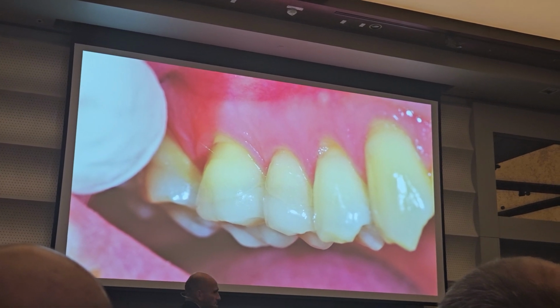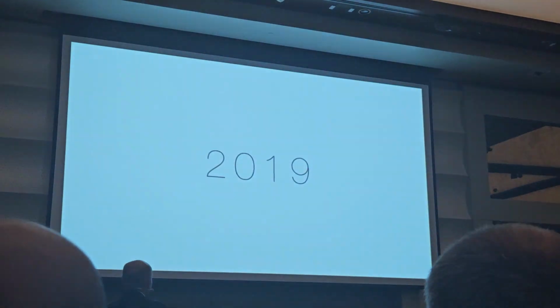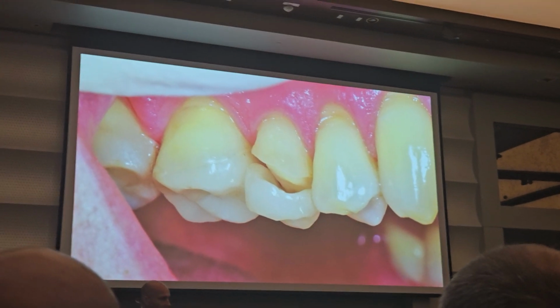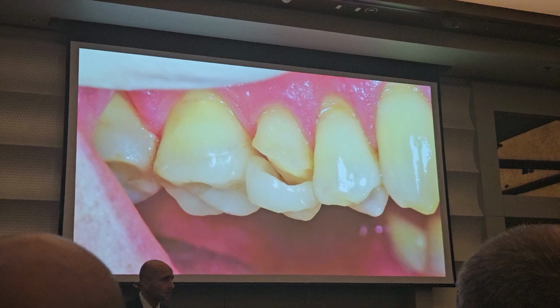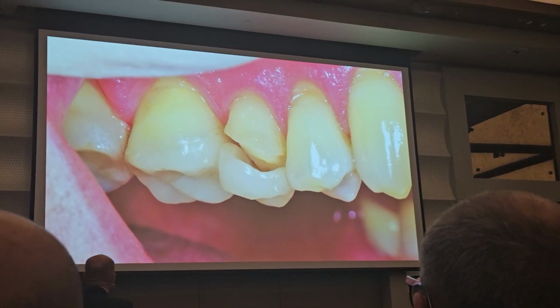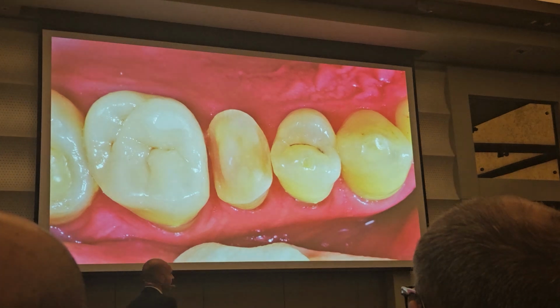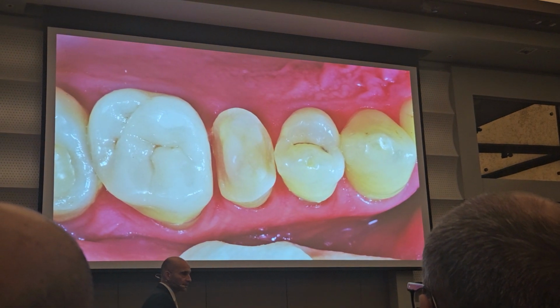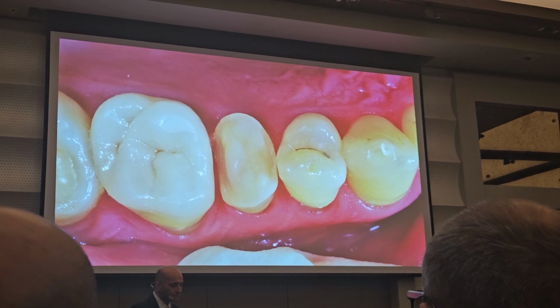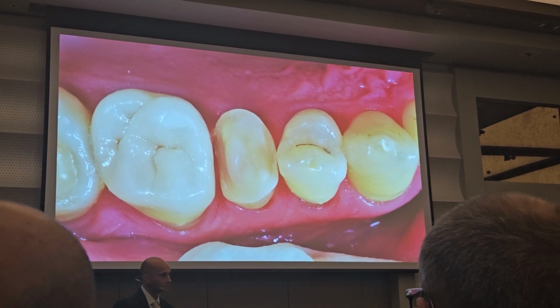But still you see the double colors, it's very ugly. 2019, the first one. In this patient I need 4, they have debonded all 4, so I will just show you one, so it's useless. And then another hour for rebonding in place. If the patient doesn't come in 2-3 days, it moves, and you cannot seat it anymore.